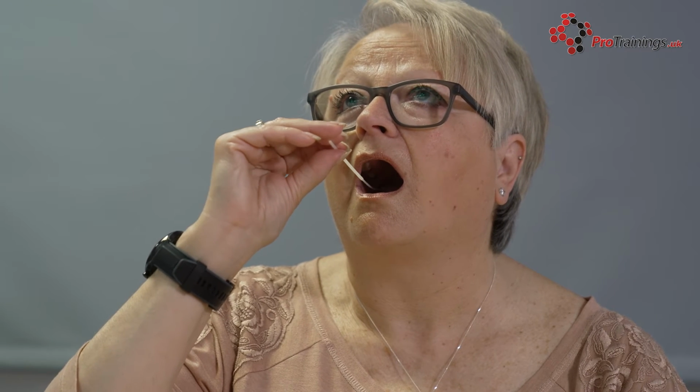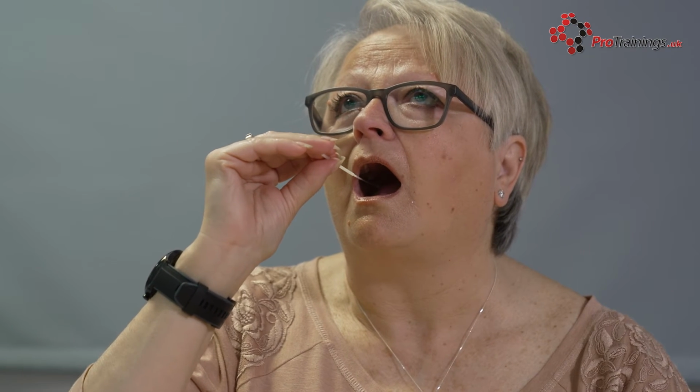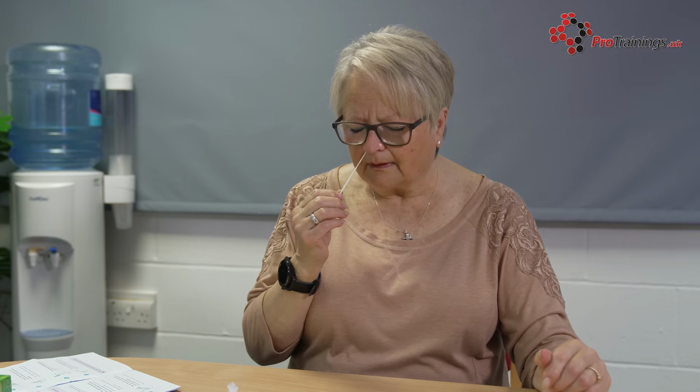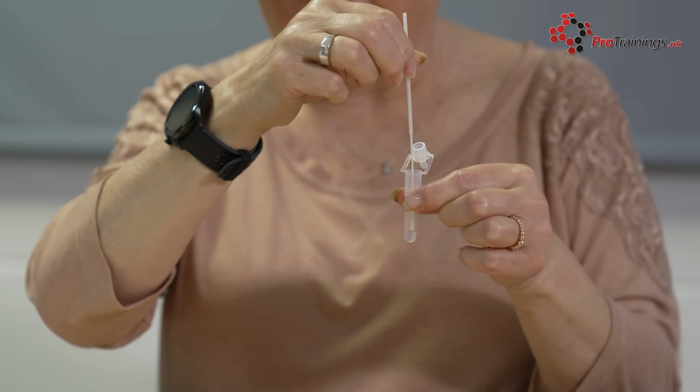Holding the swab between your fingers, open your mouth wide and rub the fabric tip of the swab over both tonsils, or where they would have been, 4 times on each side. Do not touch your tongue, teeth, cheeks or gums with the swab, as this will spoil the sample. Then put the same swab in one of your nostrils until you feel a slight resistance, making 10 complete circles. This may feel slightly uncomfortable while you're doing this.